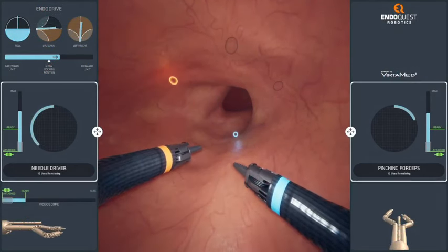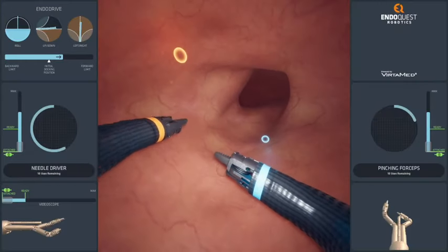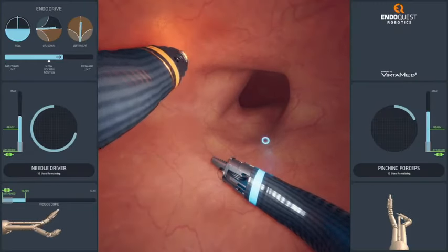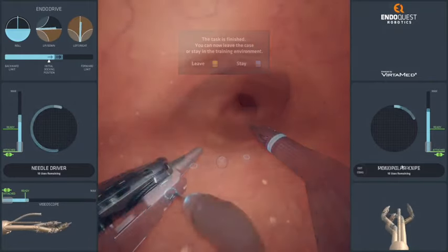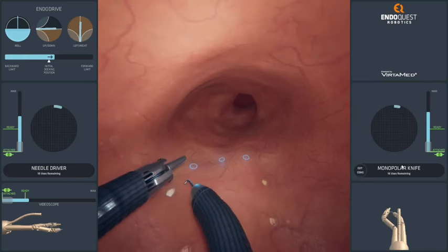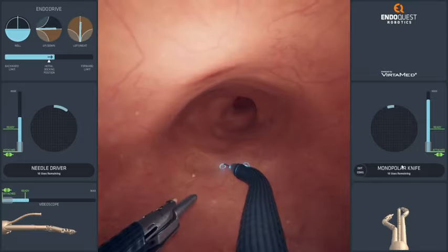For example, the center drive module focuses on endodrive navigation, instrument handling, and switching control between the endodrive and the instruments by using foot pedals. The ESD prep module involves part-task training for energy device control, simulating the lesion marking step in ESD.